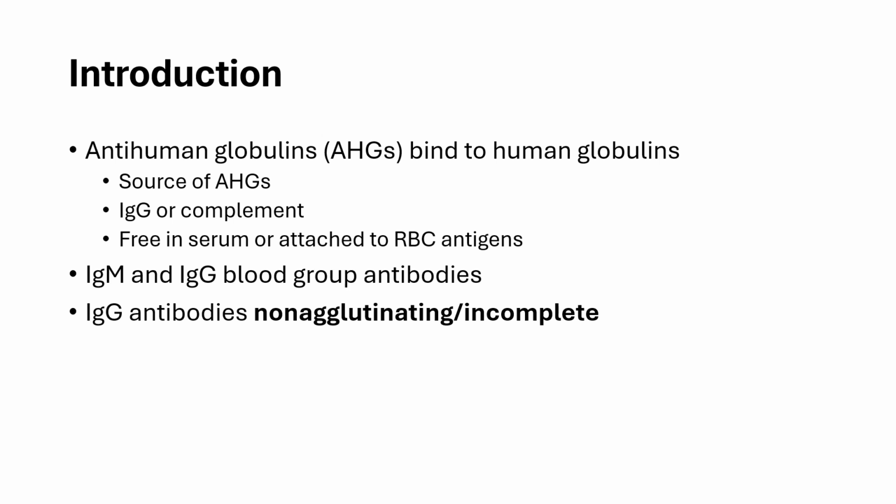Source of anti-human globulins. These are derived from animals, usually rabbits or goats, that have been immunized with human globulin components. Anti-human globulins may be polyclonal or monoclonal.